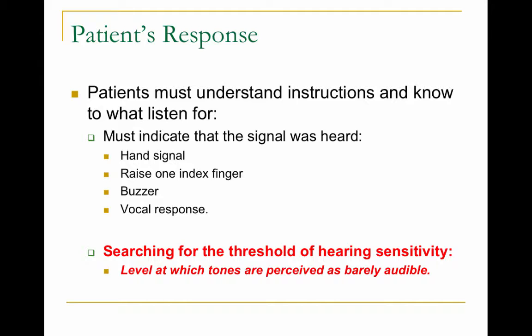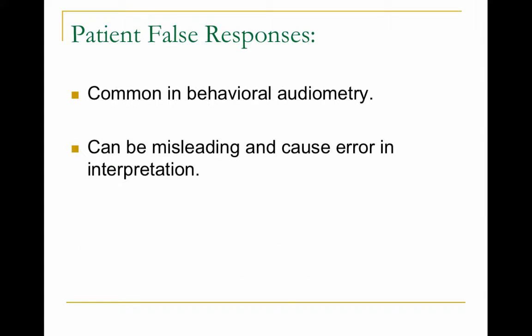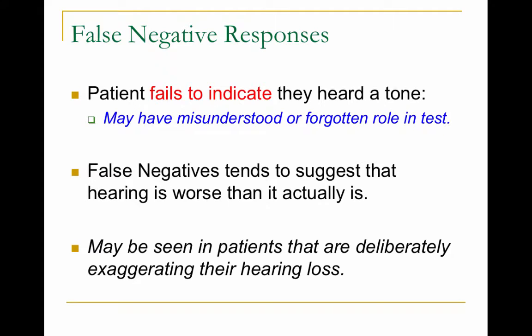What you're doing is searching for a threshold of hearing sensitivity. You're searching for the lowest level at which the tones are barely audible. Sometimes it's tricky, so you need to tell the patient that they have to raise their hand whenever they hear a sound, even if it's a very, very soft sound. False positives, false responses, are rather common, and they could cause a misleading interpretation of results.